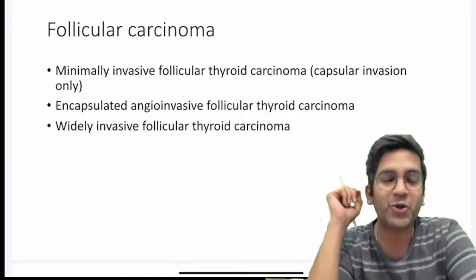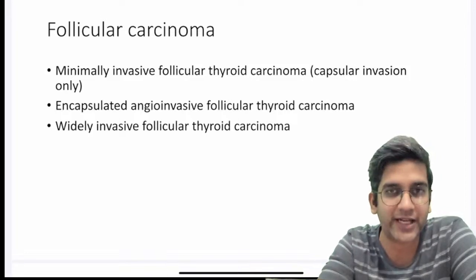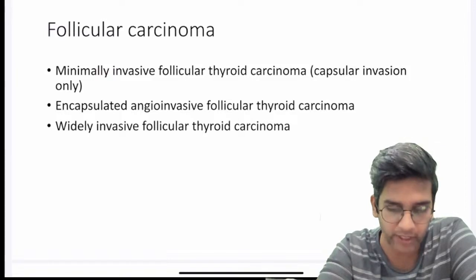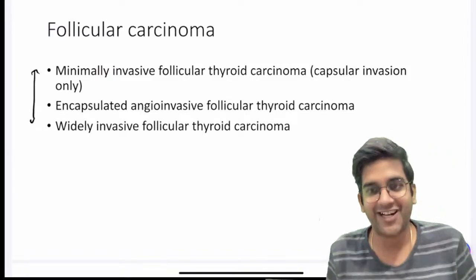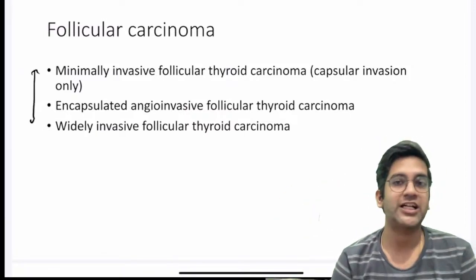So first thing, we will go to follicular carcinomas. What are the changes in follicular carcinomas and what you have to look for in a slide when you get a slide? I obviously have a look at the slides as well, from WHO or from our archives. These are the three things under which we report follicular carcinoma these days.